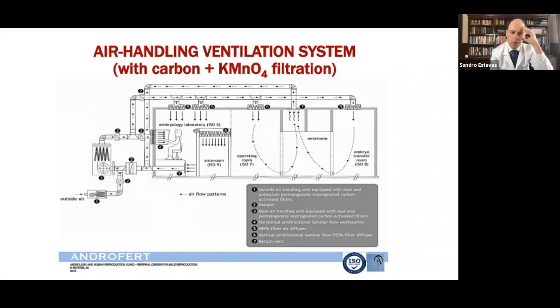I completely agree with Dr. Palmer about the importance of ante-rooms, in the sense that we have these buffers. We don't have doors between the operating theater and the IVF labs. We have two IVF labs working as mirrors, so if I have to do maintenance in one lab, the other lab can still be operational, and we have only pass-throughs.